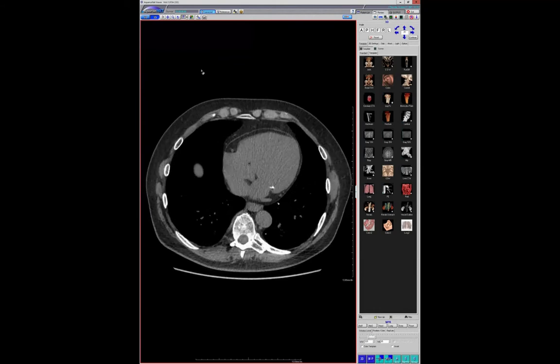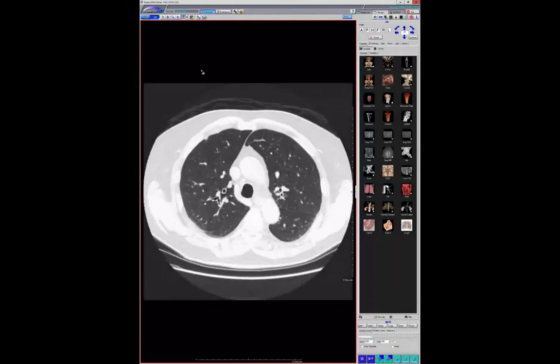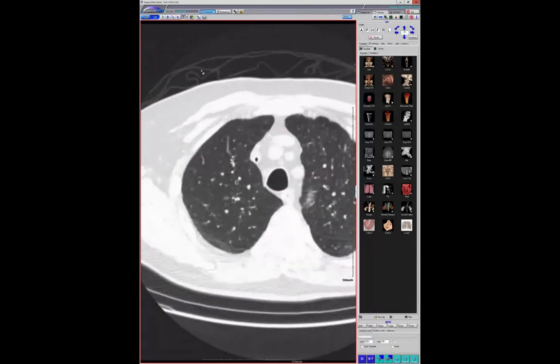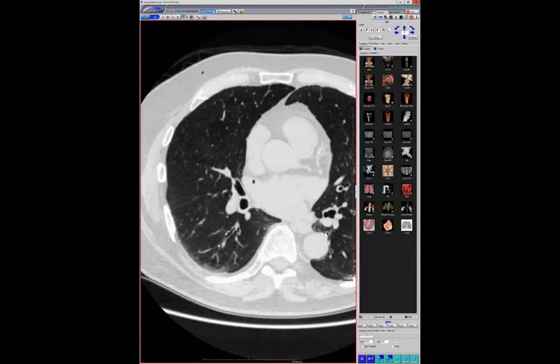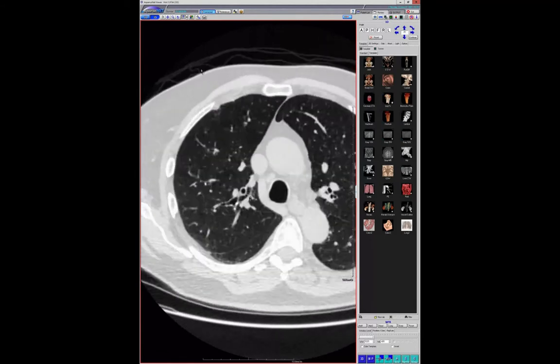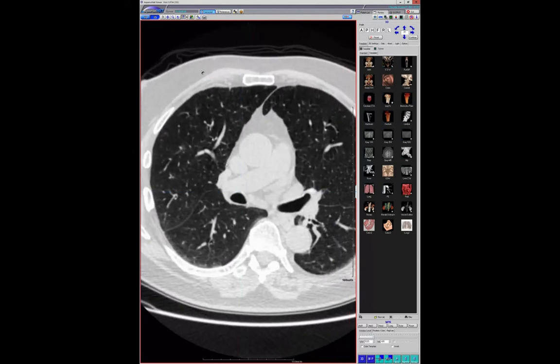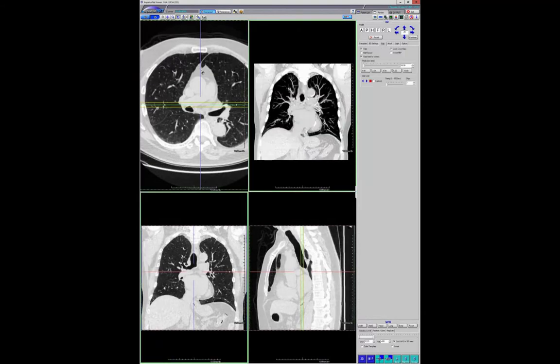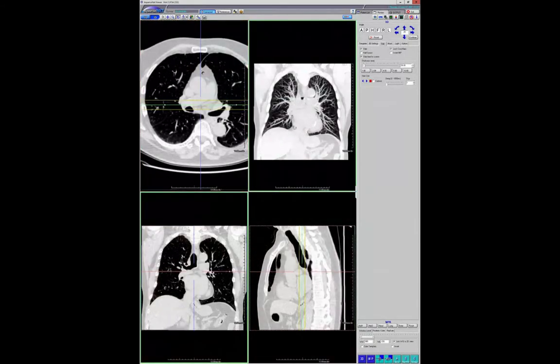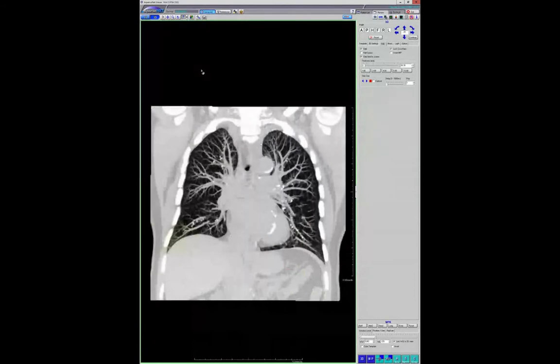Now, this is a case I sent to some of you. What is this? It's a guy with asthma. He was here for a malignancy follow-up, not this asthma. And he just has these very robust segmental and subsegmental bronchiolar calcifications, nothing centrally, trachea, main stem bronchi, even the lobar bronchi, maybe here is a little bit, but really this exuberant calcification involving these airways. And I sent it out, and some of the airways were minimally thickened. In amyloid, we've seen some airway calcification, but they're chunky and they don't look like this.